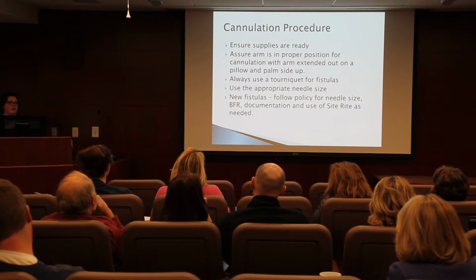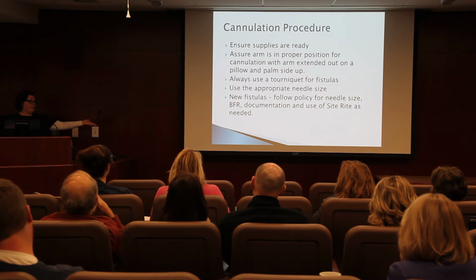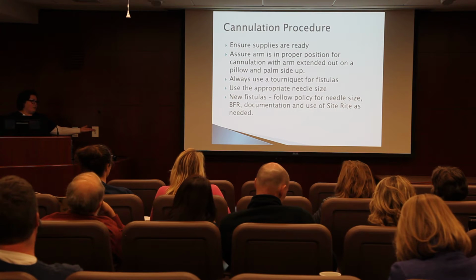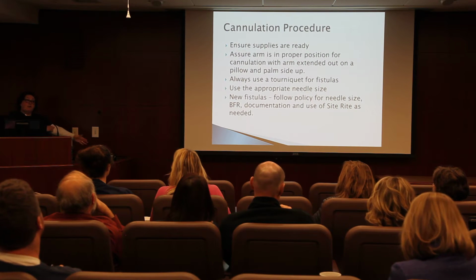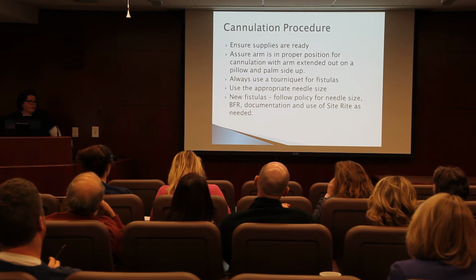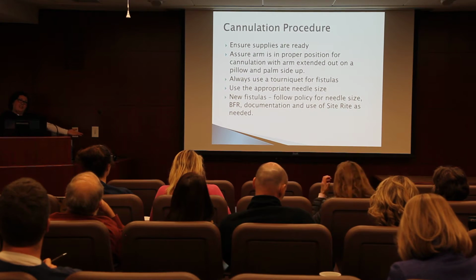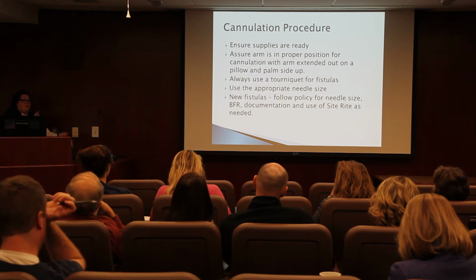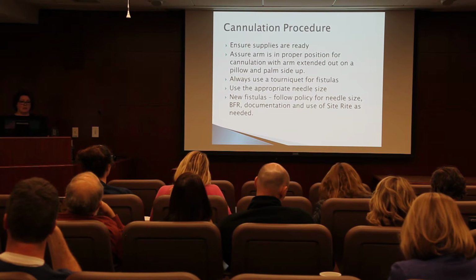Ensure your supplies are ready. Arm as far out as you can get it with your palm up is the best way to do it. Sometimes I will ask them to rotate if you just can't feel it that way. Ask them to move their arm just a little bit, and sometimes you can feel it. I know a lot of your patients are lying in bed and it's kind of hard, but if you can get a pillow to prop it up a little bit and get it away from the body and hyperextend it, or the elbow, that will bring it up even more. Don't be afraid to move their arm when you're assessing it to where you can feel it best.